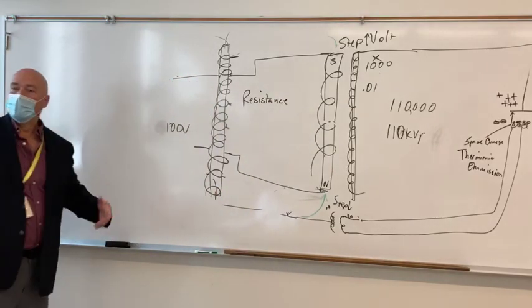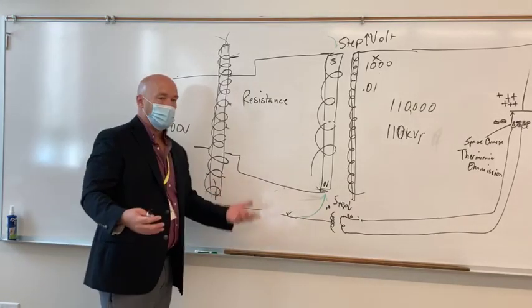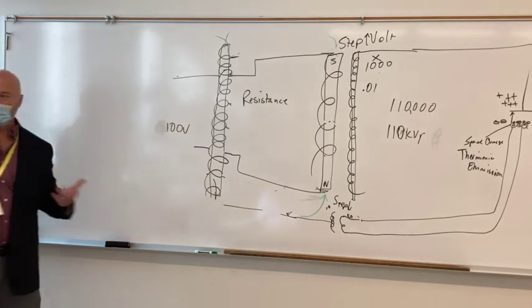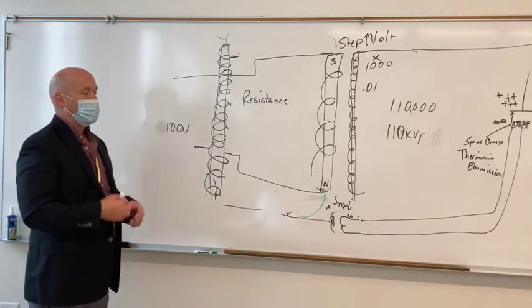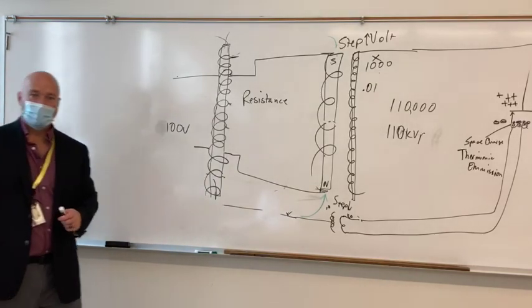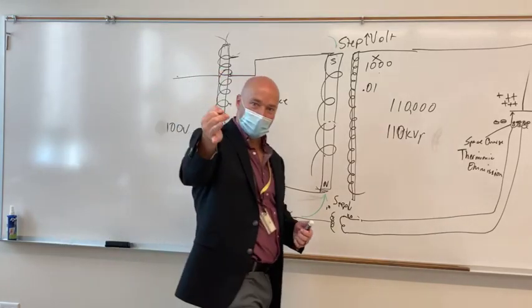Okay? So you send the electrons through the wire because they're rubbing and bumping up against each other and running up and down the wire, and you're going to have loss. It heats up, that creates more loss. So how do we deal with heat in the X-ray tube? Three different ways we talked about. The fan, that was the oil.